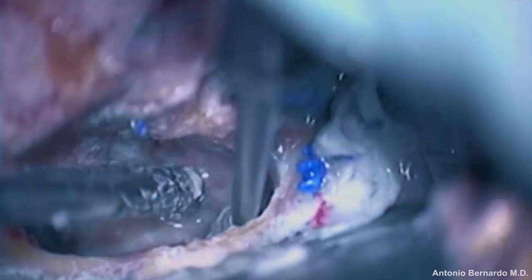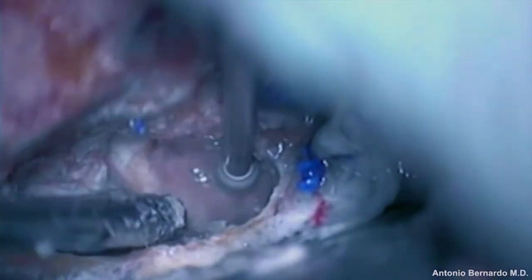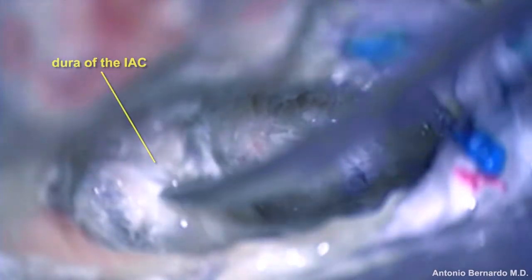Once the internal acoustic canal is skeletonized, the drilling proceeds inferiorly and medially, exposing the dura of the posterior fossa. A little shell of bone is left in place at the level of the petrous ridge in order to be able to sustain the spatulas. The posterior fossa dura is completely uncovered, and the dissection proceeds medially towards the clivus until the inferior petrosal sinus is exposed. The dura of the canal is completely uncovered.